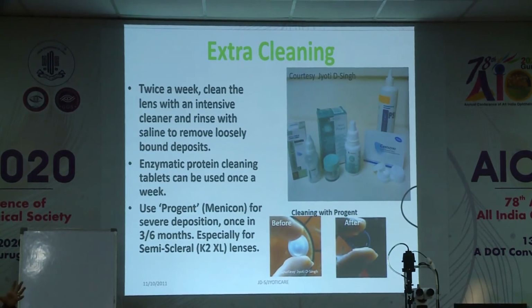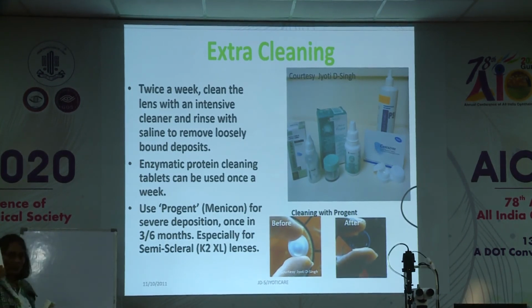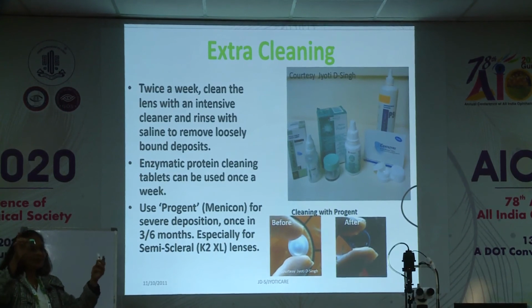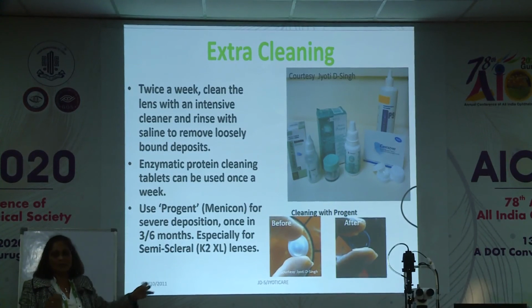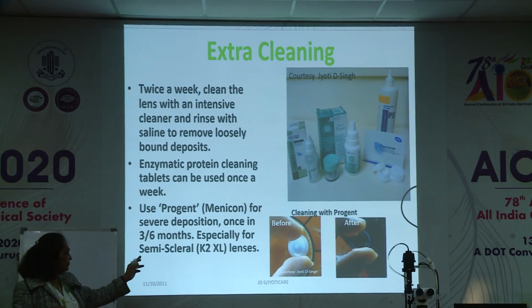So these are the extra cleaning that is done for all Rose K lenses. We have the intensive cleaner to clean the lens with. We have the protein cleaning tablets to soak them in, and then to immerse the lenses in that for a period of 4 hours and then put them back in RGP Sparkle. And we have the 3-monthly cleaning of Progent. Now the Progent is a very effective cleaner. As you can see in the diagram, the lenses do pick up, especially semiscleral lenses, they do pick up hard-bound deposits. And so you have Progent cleaning.